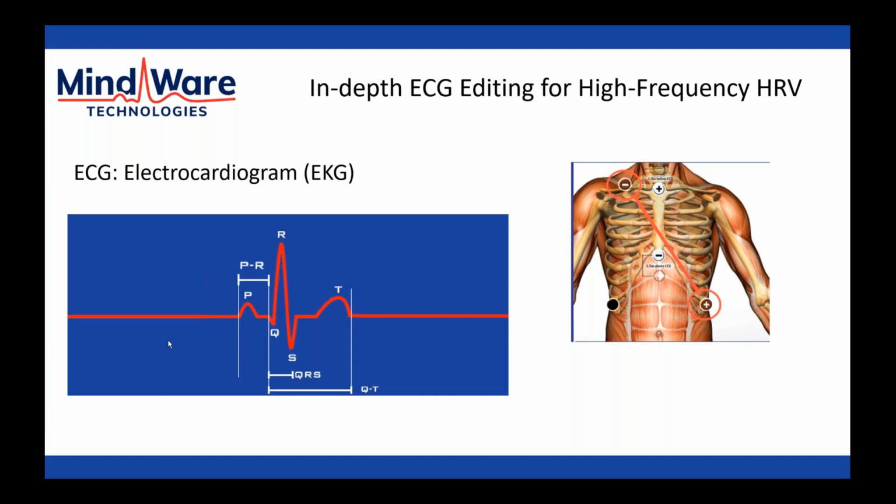So that is a general representation of an ECG. Like I said, the most important thing, if you took anything away from that, is the R peak being positive and being easily identifiable, because the R peak is what we're going to use to identify beat-to-beat timing.